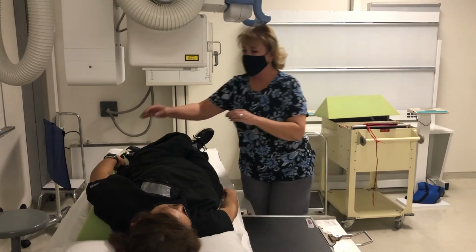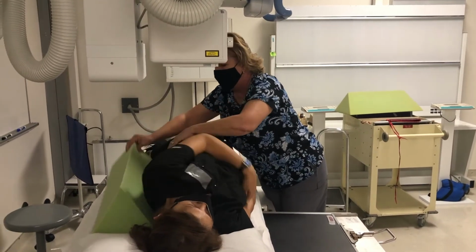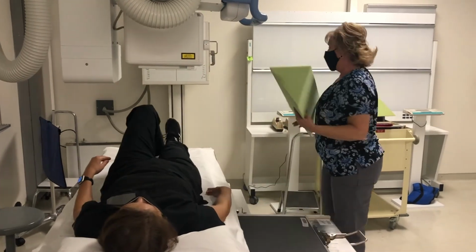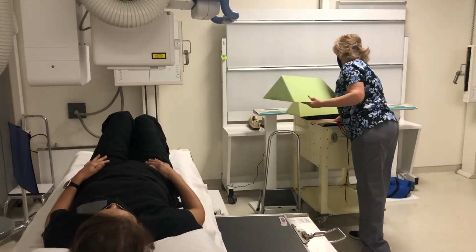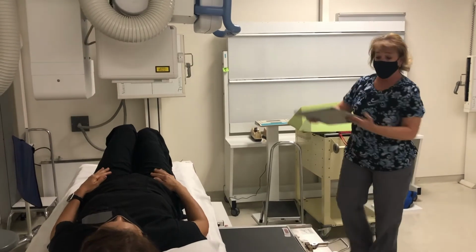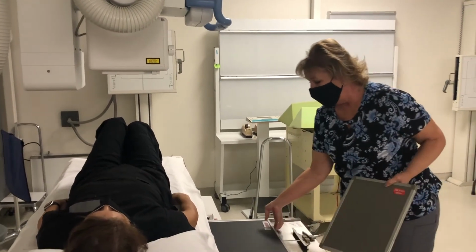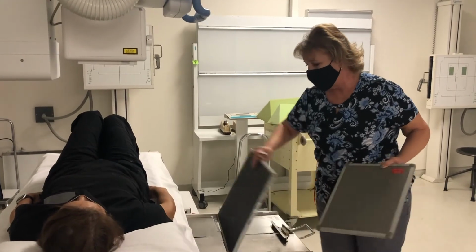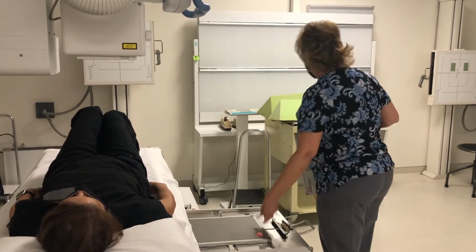So let me take this sponge out now. You can lay back flat. If by chance I miss the bladder on one or more of these images, I'm going to show you how to do a bladder shot.